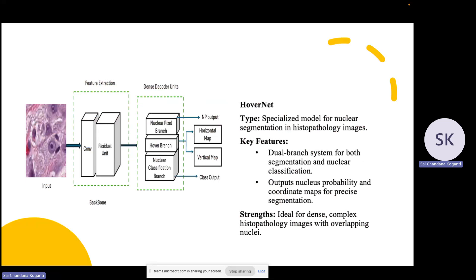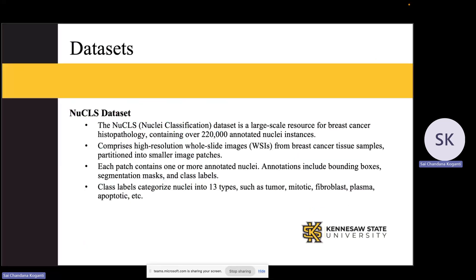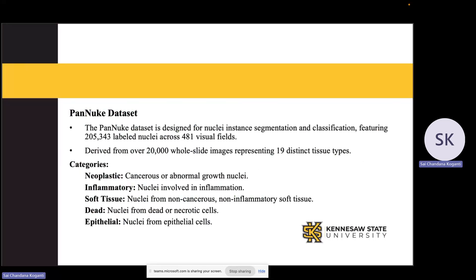Now let's look at the datasets used: PanNuke and NuCLS. The NuCLS dataset has over 220,000 annotated nuclei from breast cancer cells. It contains high-resolution whole slide images, or WSIs, split into small patches. Each patch has labeled nuclei and consists of 13 different cell types, such as tumor, fibroblast, and plasma cells. The PanNuke dataset is designed for nucleus segmentation and has 205,000 labeled nuclei across 19 tissue types and 5 cell types: neoplastic, inflammatory, epithelial, soft tissue, and dead cells.